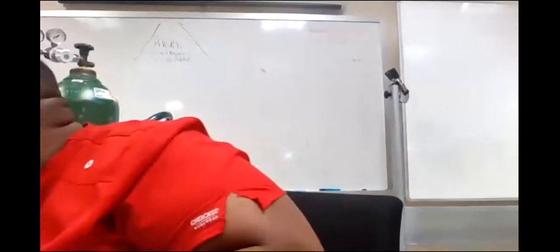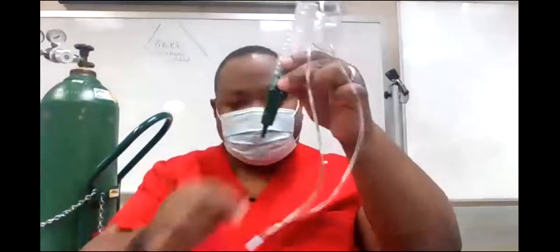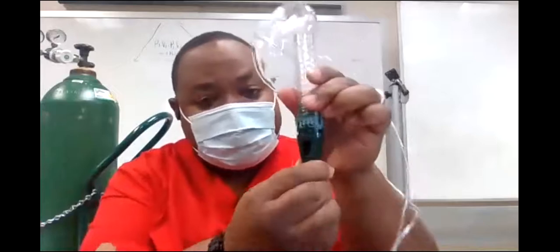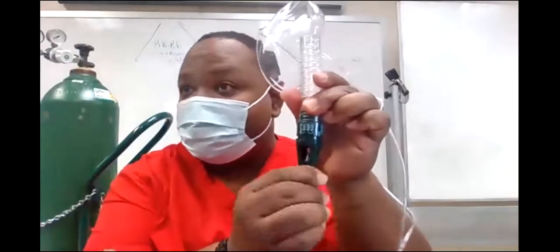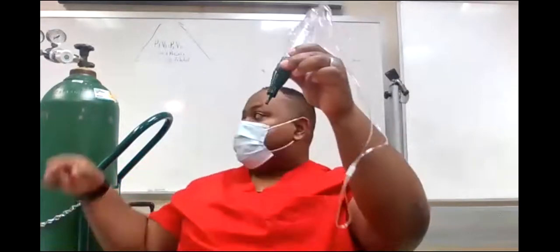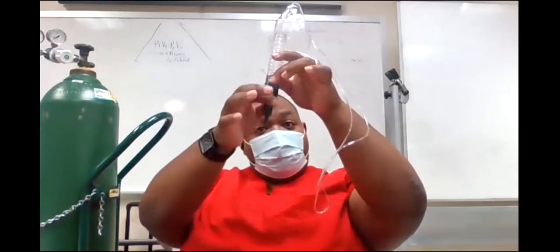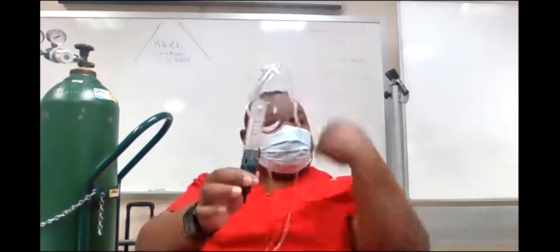Outside air comes in, right? So you have your flow coming from your device, and it would be, let me see if I can pull this off of here. So you'd have your flow going from here to your tank, okay? And when it gets to the windows, it will start to entrain outside air depending on how open you have it, okay? So for instance, if I have the windows completely closed and I have 100% oxygen coming from the machine, from the tank, 100% coming all the way through here, 100% right here. If the windows are closed, then it's going to continue to be 100% to the patient, all right?